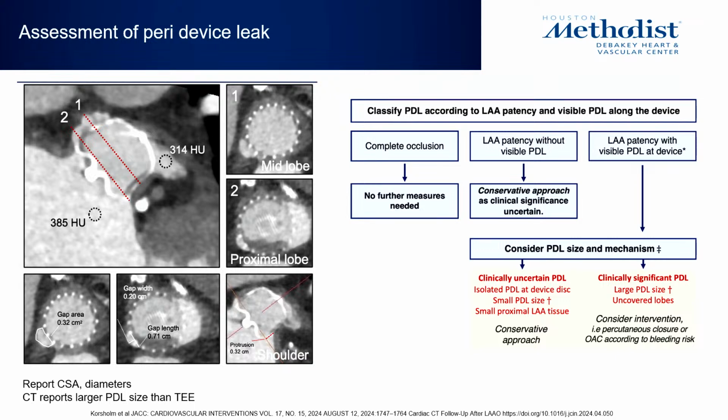Now, if you have patency of the left atrial appendage, but there's no significant peri-device leak noted, that is attributed to incomplete endothelialization. And at this point, we don't really know what to do with that. And so a conservative approach is recommended.